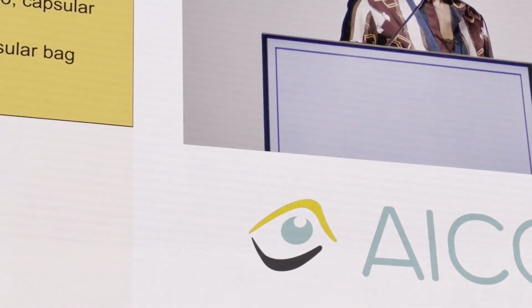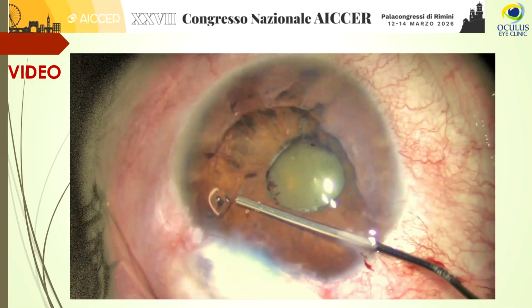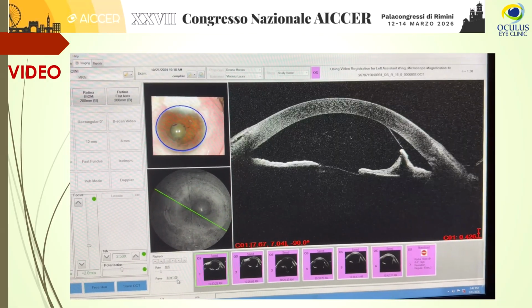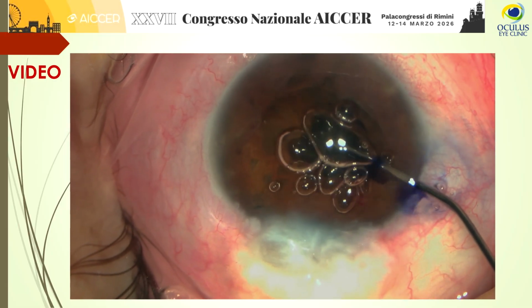So I guess there are a few questions here. The axial length of the eye is normal or small? 21. So it's a small eye. We have to ask ourselves, why is the AC so shallow? It was not very well seen in this picture. There were other pictures where we can see it better, but you will see it in the video. The iris is attached to the cornea or endothelium from 2 o'clock, all the inferior half, up to 8 or 9 or 10 o'clock. And the central anterior chamber is also shallow. Yes, the remaining anterior chamber was 2.1. Okay, so it's not terribly bad.